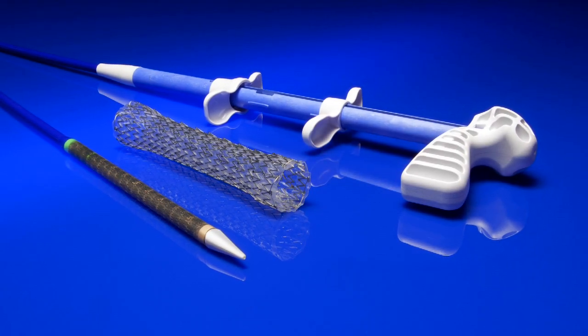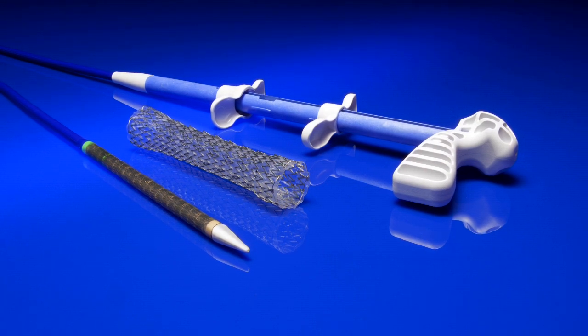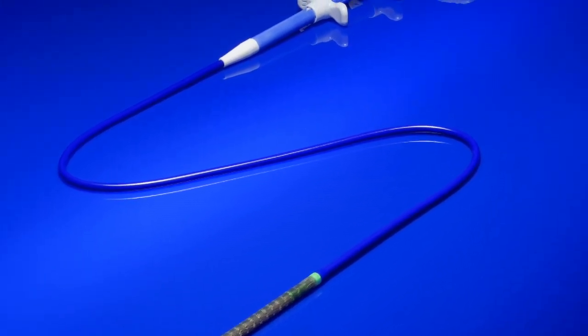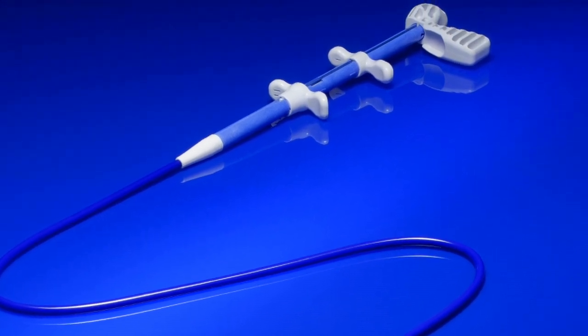Introducing the Endomax fully covered esophageal stent system. The Endomax is intended for maintaining esophageal luminal patency in esophageal strictures caused by intrinsic and/or extrinsic malignant tumors, and for occlusion of esophageal fistula.